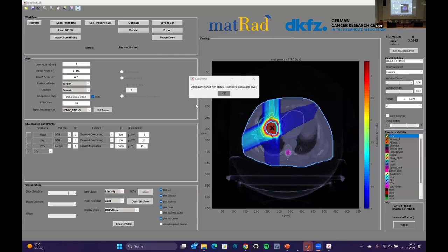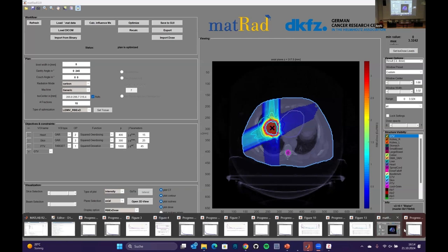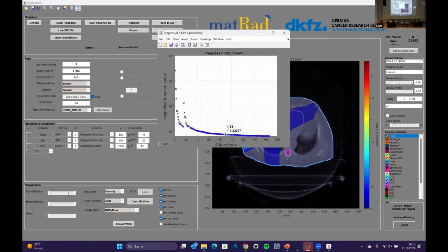So what you can use to have these boundaries, let's discuss this, maybe, because if someone's interested, I will not stop their interest. How you can ensure this positivity is that you add a barrier function on all the intensities, which is a logarithm.